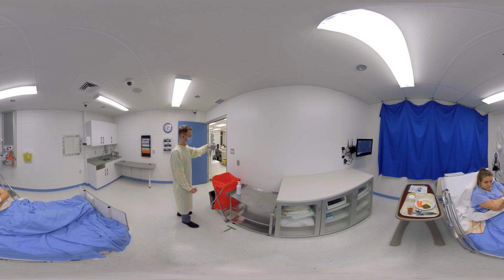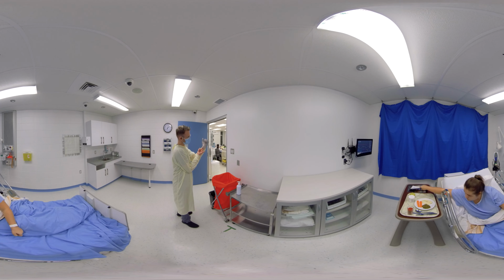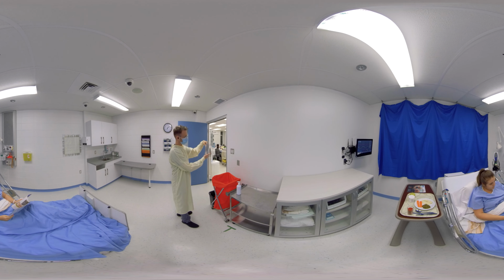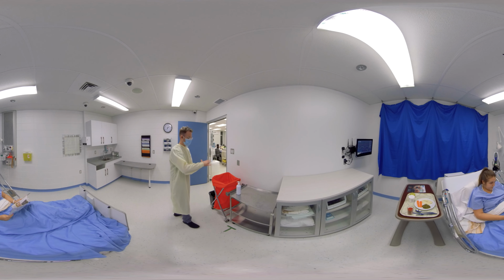He then rolls it up into a ball in the gloved hand and keeps it there. After, he slides 2 fingers of the ungloved hand under the cuff of the second glove without touching the exterior surface. He stretches it and turns the glove inside out and over the first glove. He discards the gloves in the designated receptacle. After, he washes his hands with an alcohol-based solution before continuing the removal procedure.